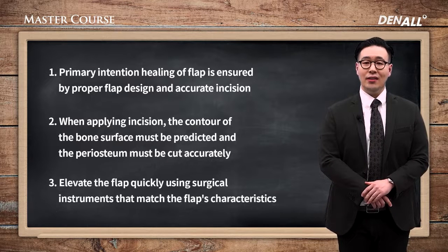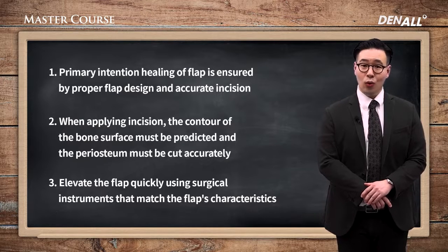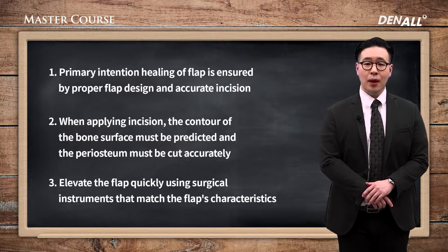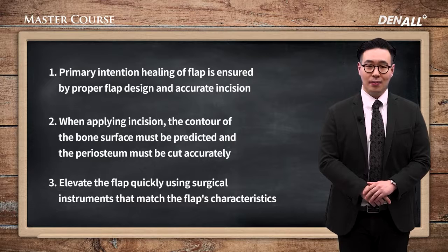Third, you need to understand the characteristics of surgical site and flap before surgery and use appropriate surgical instrument to do quick, accurate, and damage-free full-thickness flap. You need to be experienced in doing this.